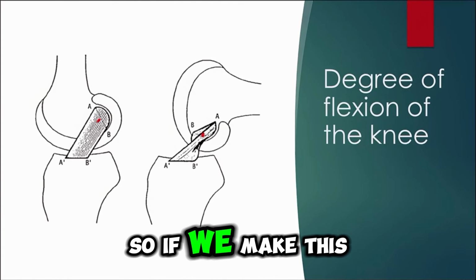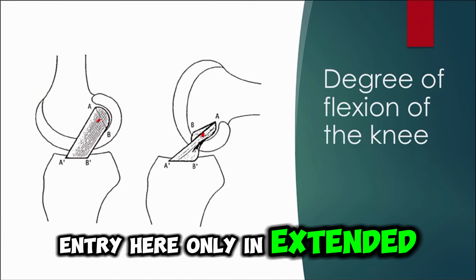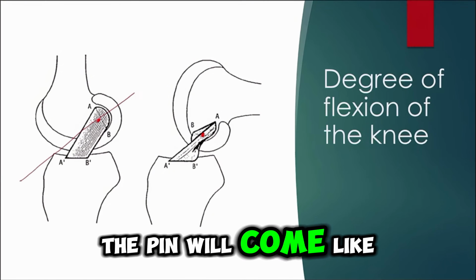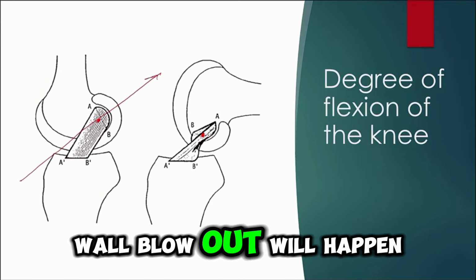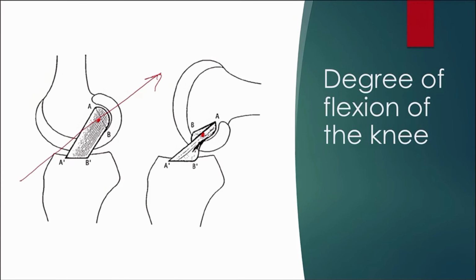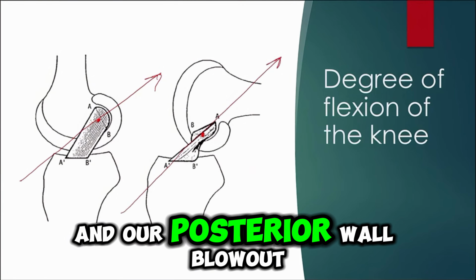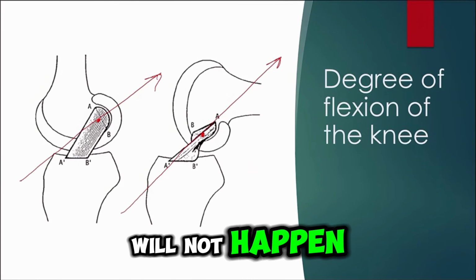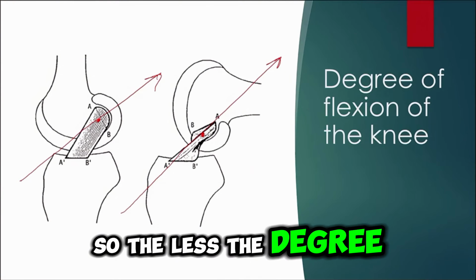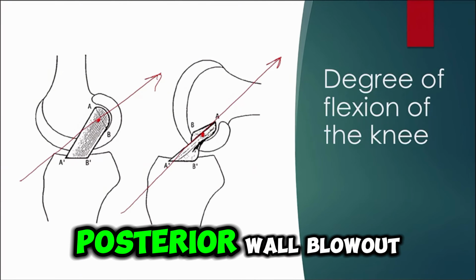So if we make this entry only in extended position, the pin will come like this and posterior wall blowout will happen. But if we flex the knee, then the wire will come like this and posterior wall blowout will not happen. So the less the degree of knee flexion, the more chances of posterior wall blowout.